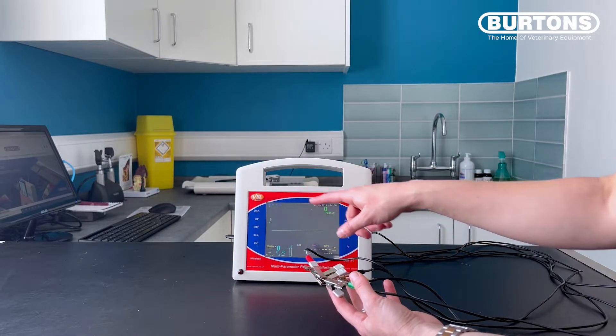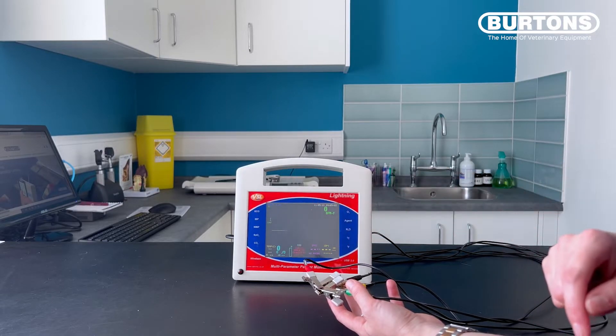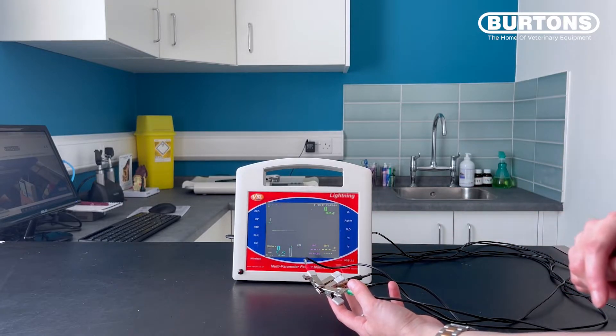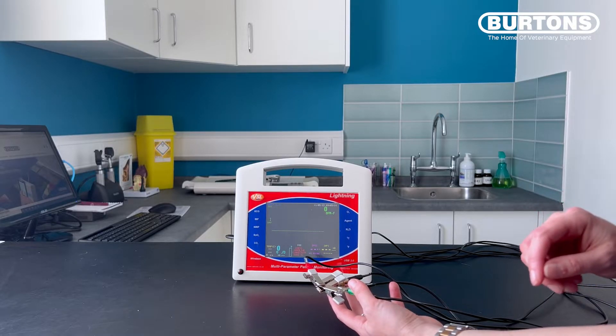So on lead one, we have a nice flat line. On lead two, we have a nice flat line. And on lead three, we have a nice flat line. And we're having this flat line because all of the cables are picking up on the same signal.